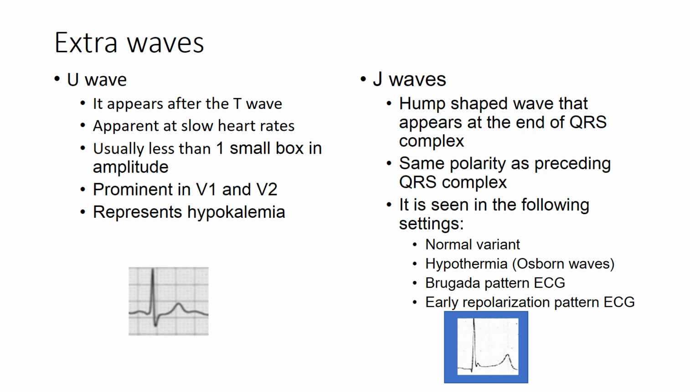Here we conclude the discussion on ST segment, QT interval, T wave and extra waves.